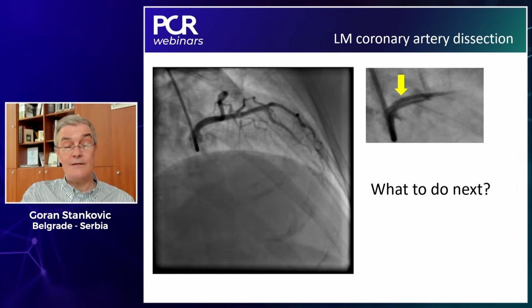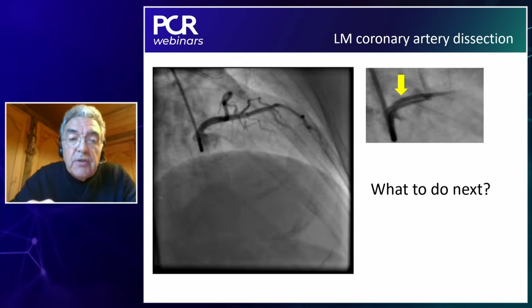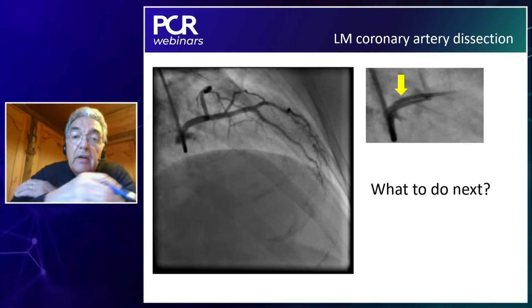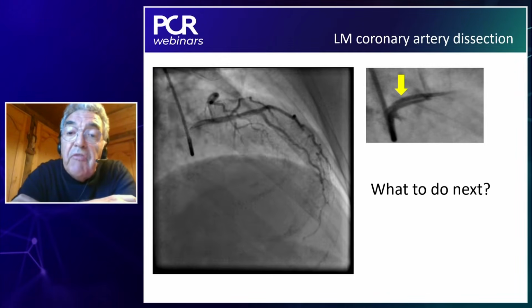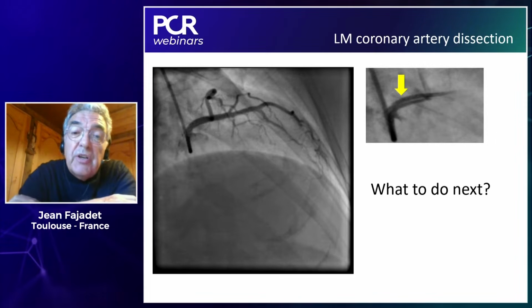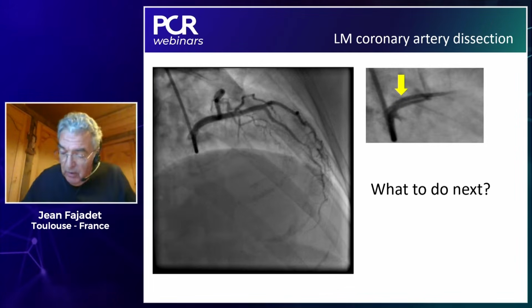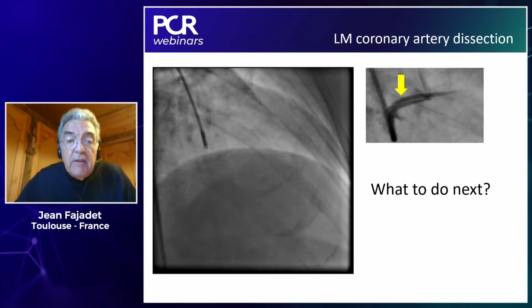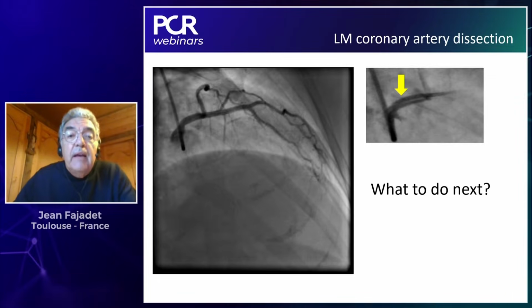No, I think that if we can stay on this view and looking at the left main dissection, okay. All of you immediately feel the difficulty of this left main dissection, which is a large dissection involving all the length, at least all the length of the left main. So what to do? Goran says first, no more angio. Thierry, have you an idea?